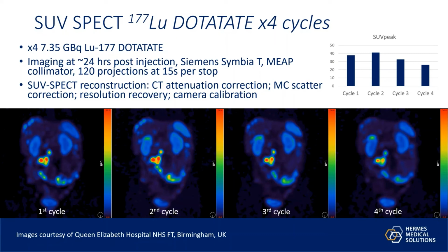And also there, I have plotted the SUV peak for the hottest tumor going through these cycles.